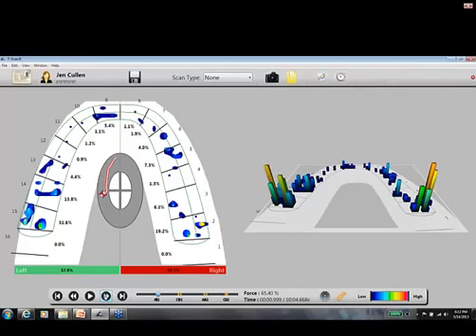But as I come in, there's kind of these spikes that happen on 2 and on 15. And I've got over 31% of force on number 15. And my pressure is more off to the left. And we want this to be right down the middle zone. And so that would be an area that we would look at right away.